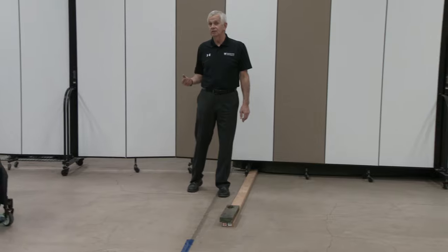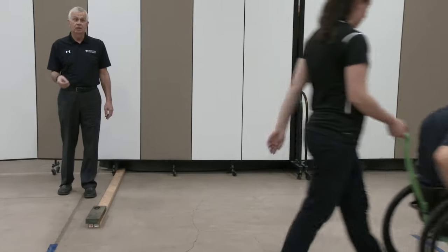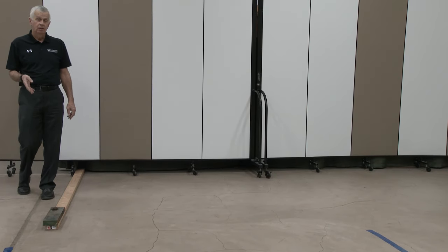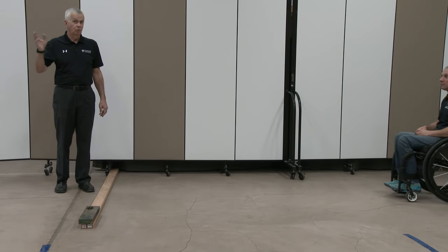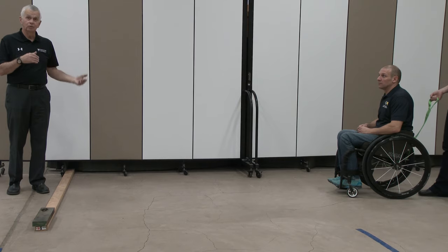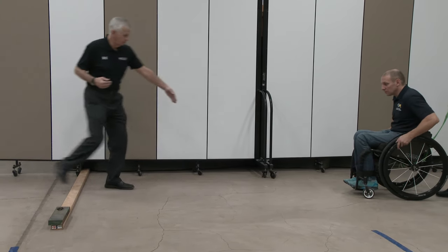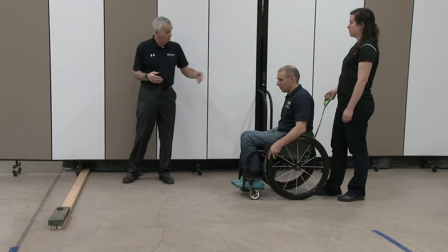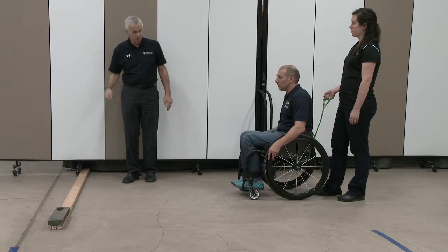That was a more advanced version of the technique, where the rear wheels landed on the far side of the threshold before the casters landed. When we're curb climbing, we try to build that in with a simpler version. So we'd like you to not come so quickly — maybe start a little further forward — really just one push rolling, then one push popping casters down before the rear wheels go over.